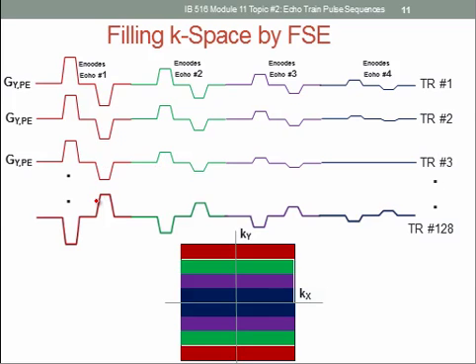So what ends up happening is, for this echo, this little text box says it encodes echo number 1. Although these are changing, the amplitudes will stay within a range of certain high values of KY, both near KY max and near KY min. Similarly with the second echo, which has intermediate values, a little lower than the K-space lines for echo number 1. So they stay around these regions of K-space.